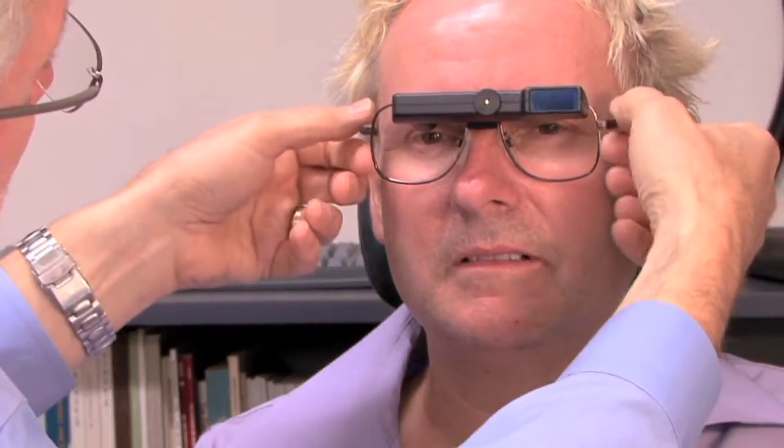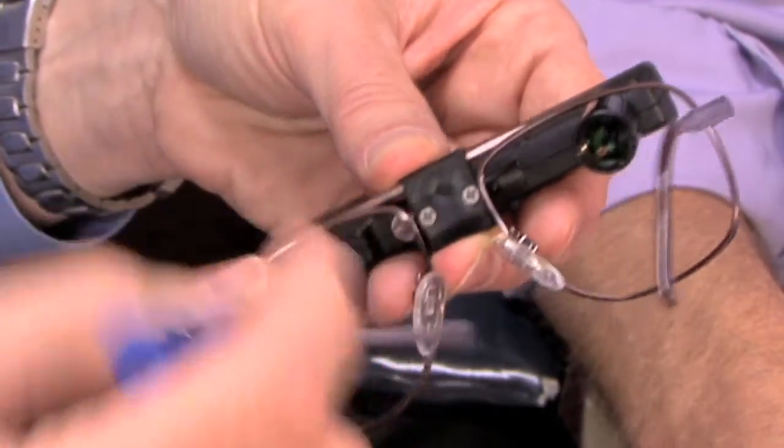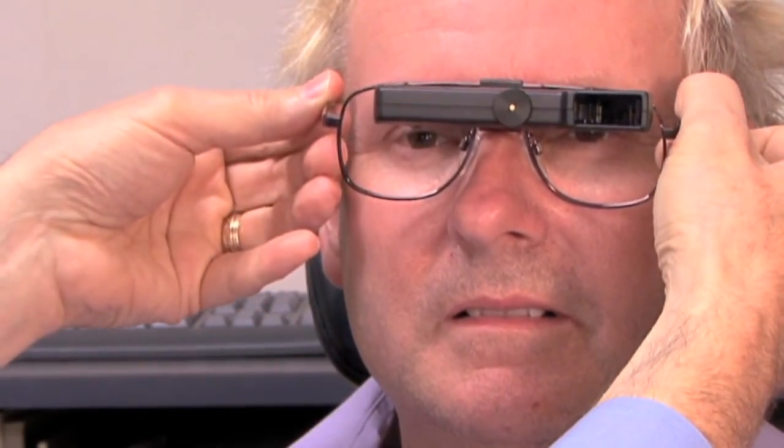Once you have that set and the temples are snug behind the ear, take it off, tighten the fitting screws just snug enough so that it won't move, and place it back on the patient. Make certain that the temples are hard down on the ear, because if they're up, then the angle of the telescope won't be proper. You want it all the way down hard.